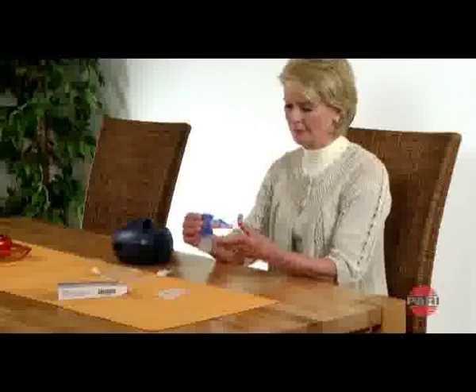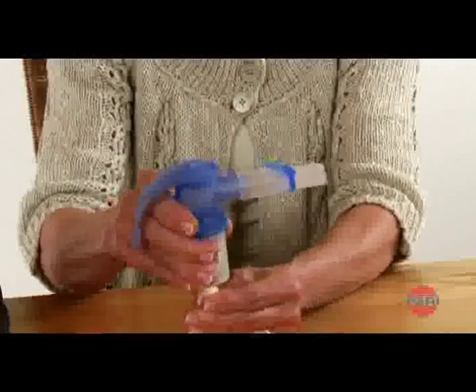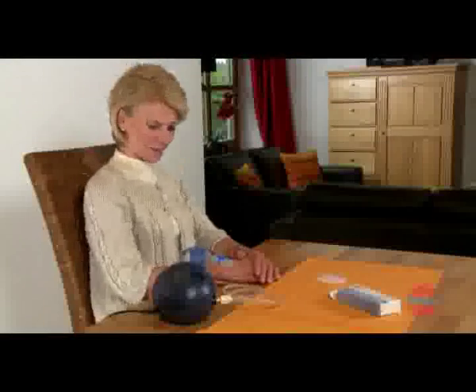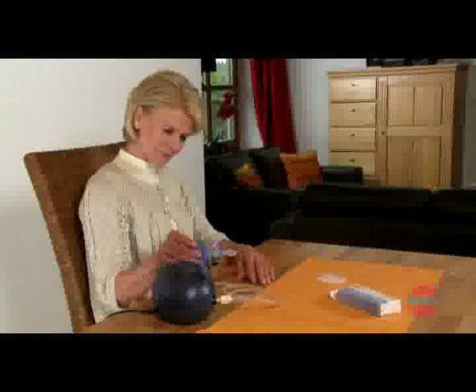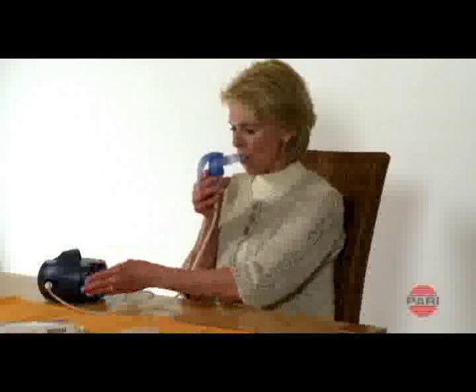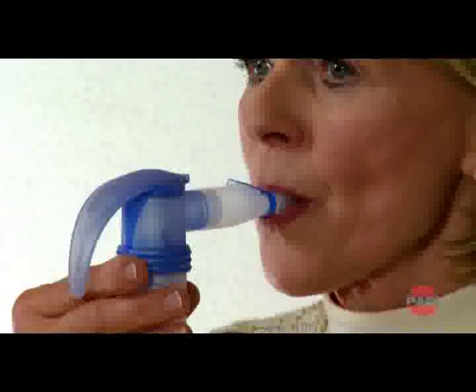Use the connection tubing to connect the nebulizer to the compressor. During inhalation treatment, you should sit upright and relaxed on a chair. Hold the mouthpiece between your teeth and enclose it with your lips. Now switch the appliance on. Breathe in and then out through the mouthpiece, as slowly and deeply as possible.